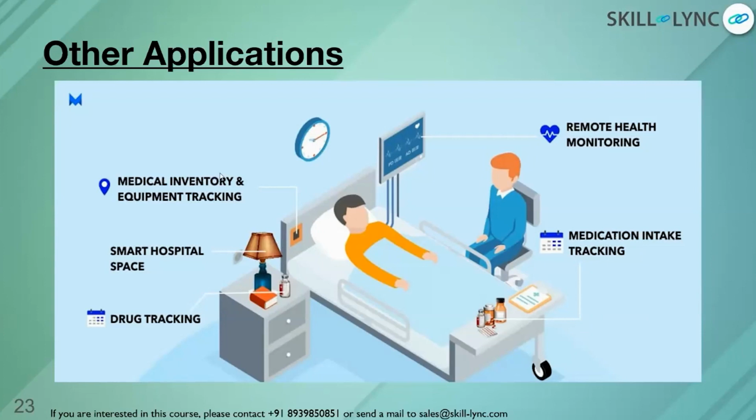So for such inevitable errors, consider if you put an RFID tag or a barcode tag, like in our malls, where they put them on products, right? If you have a barcode, or a near field tag, or an RFID tag, that particular location can be tracked in the nearby environment through Wi-Fi, so that we can track that object with RFID. We can easily point out where the device is.